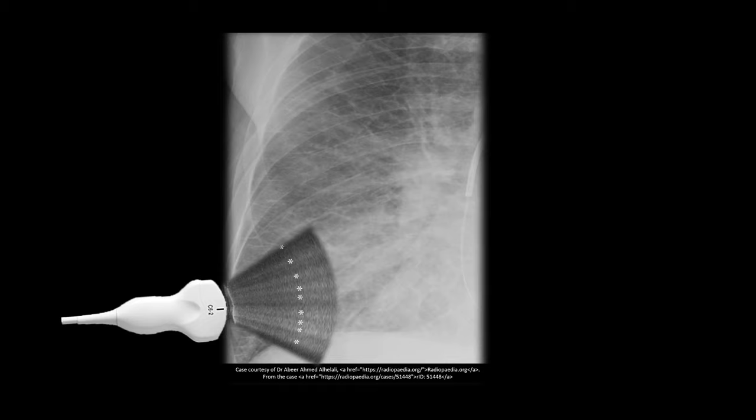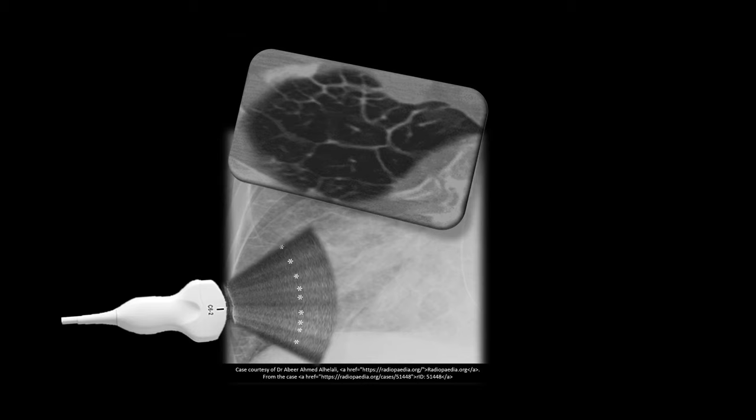On chest x-rays, this interlobular septal thickening will be represented by the Kerley B lines in the periphery of the lungs, demonstrated by these red lines. These B lines in the periphery of the lungs are well defined in the ultrasound as well. They are delimited by these white asterisks. If you trace a line at this level and make axial slices on a CT scan, you should see the interlobular septal thickening like that.